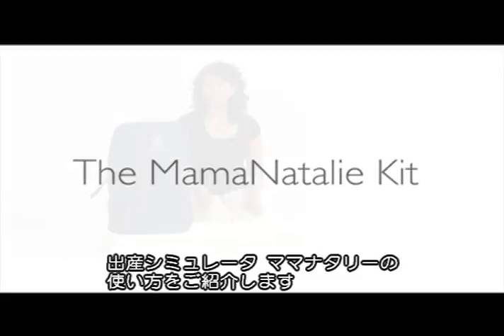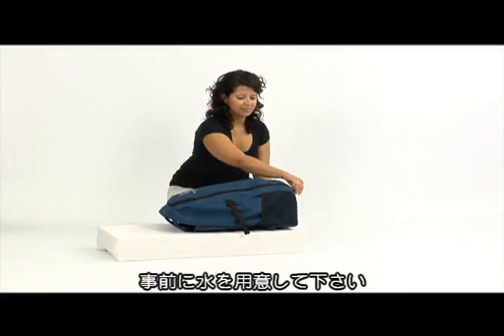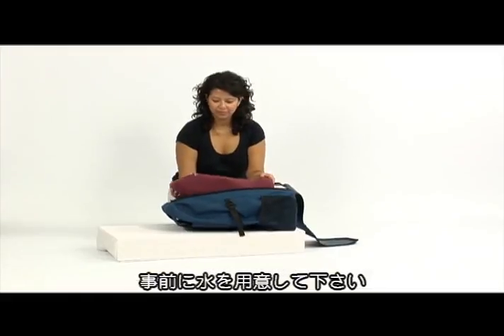This video will show you how to set up and use your Mama Natalie birthing simulator. In addition to your Mama Natalie kit, only water is needed.